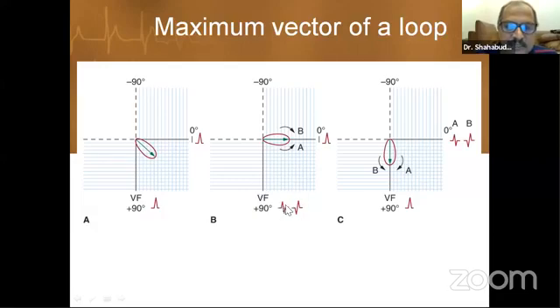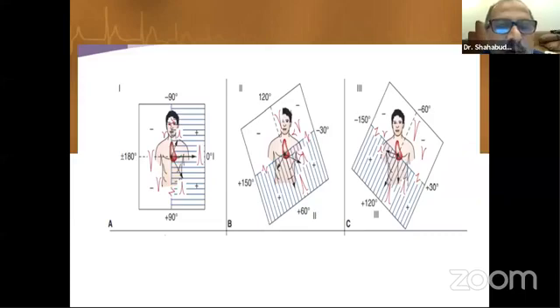This will be equiphasic. That is, this is at a right angle to the aVF pole. But if we consider this loop directed towards aVF, it will definitely produce a positive deflection in aVF, but the same thing will be equiphasic in lead 1. So this is the explanation why the left one is somewhat equiphasic: it is due to their loops and due to their hemifield mechanisms.